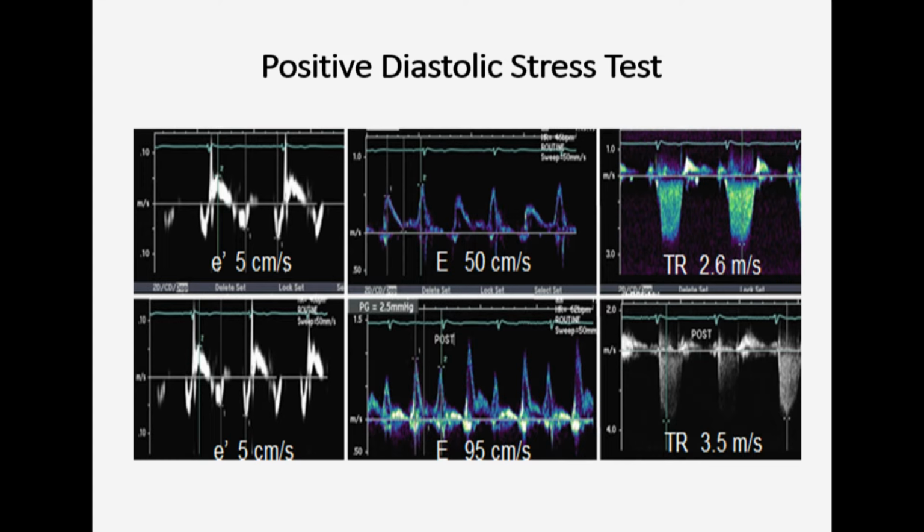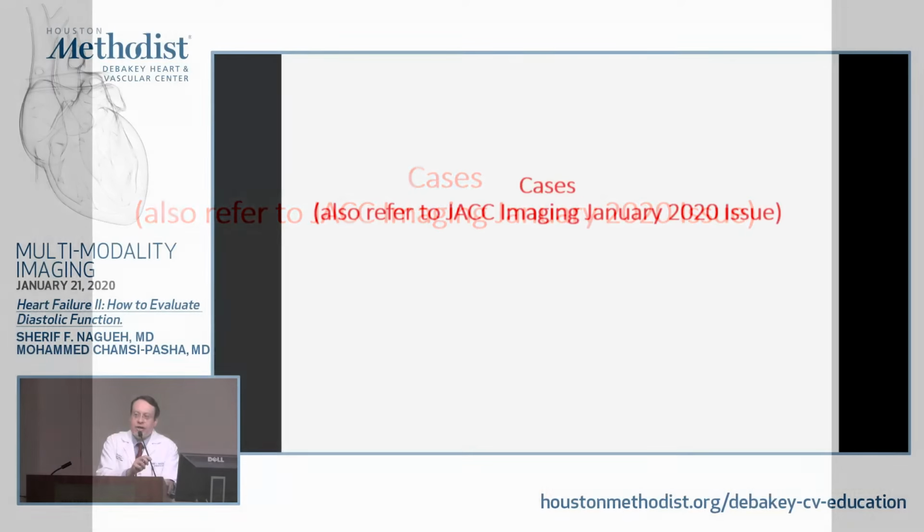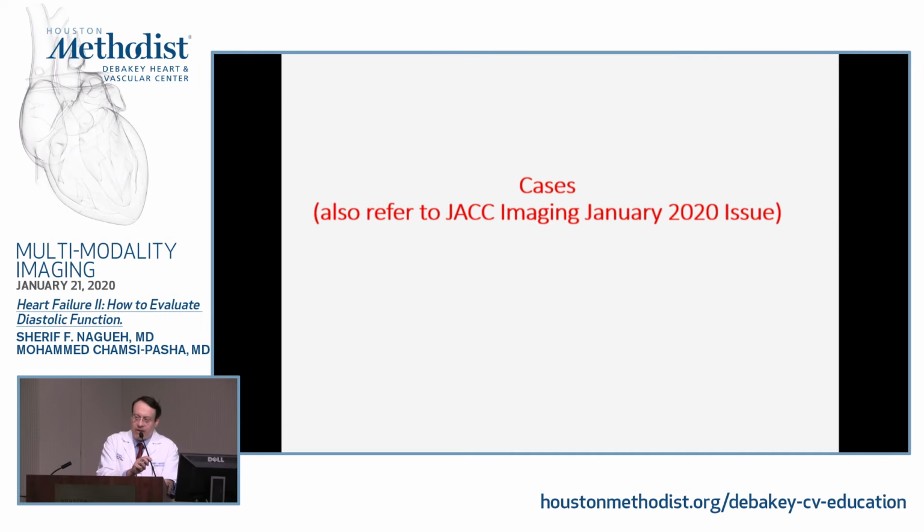least 49 millimeters mercury. So we'll see some cases, and if you guys have access to JACC Imaging, I don't know if this is available for many of you or not.